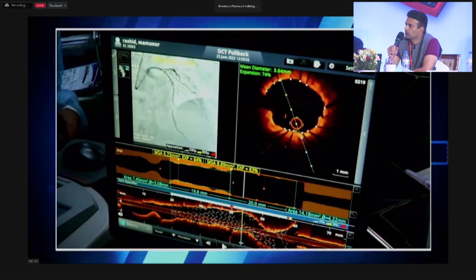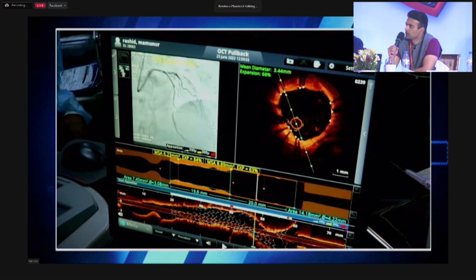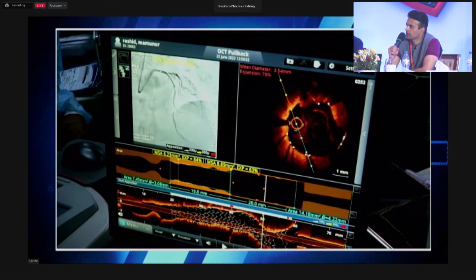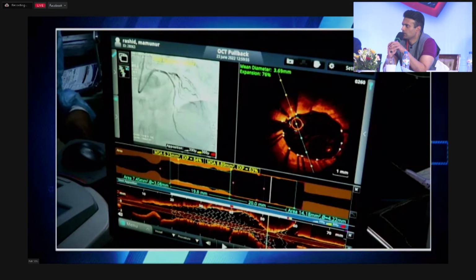Go. More. Keep coming, there. Okay, no, you've gone past it. So go distally again. Proximally it is. No. So look at about the 2 to 3 o'clock position. Go distally from here. Yes, probably it is the ghost shadow due to blood, RBC.